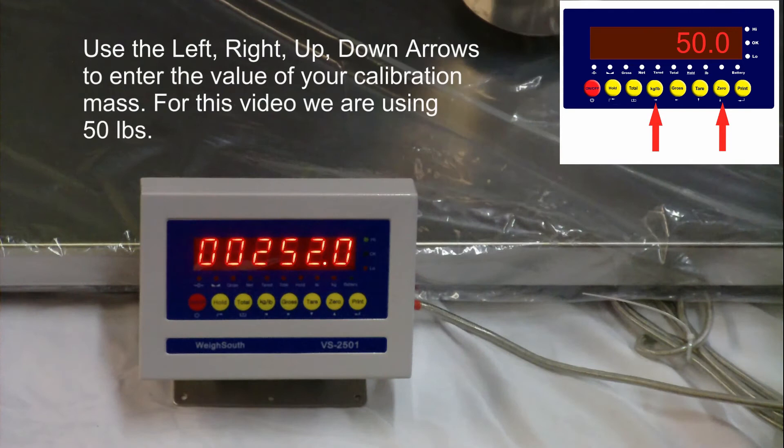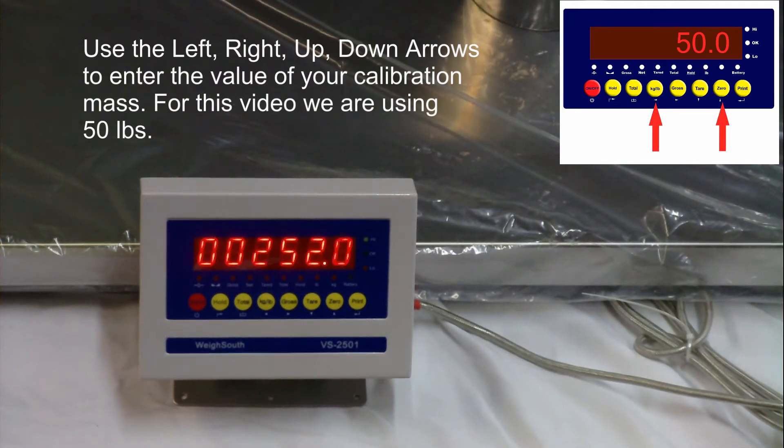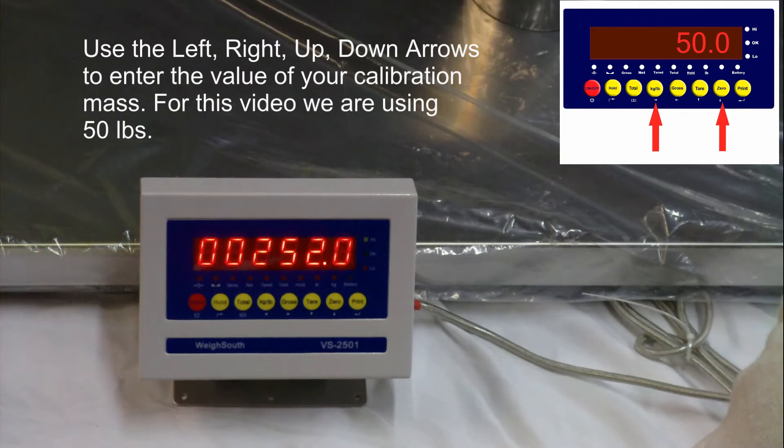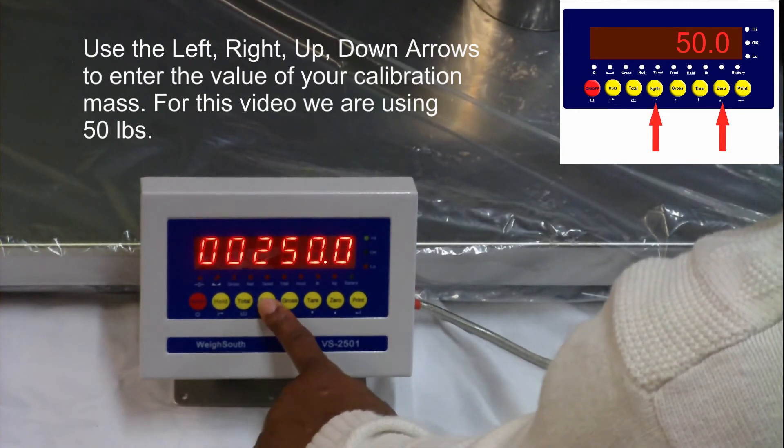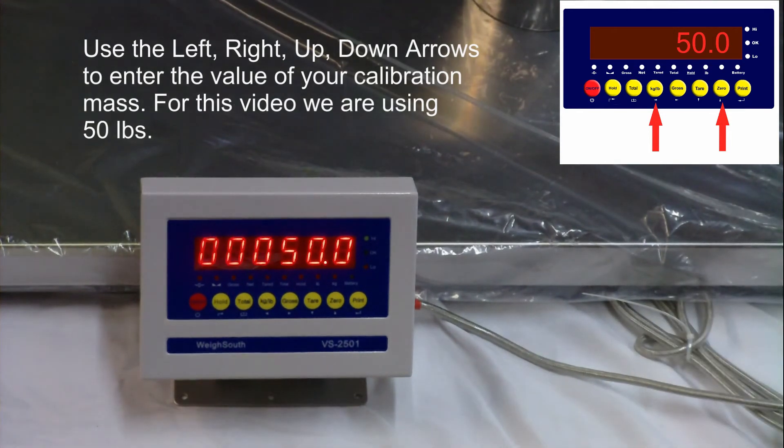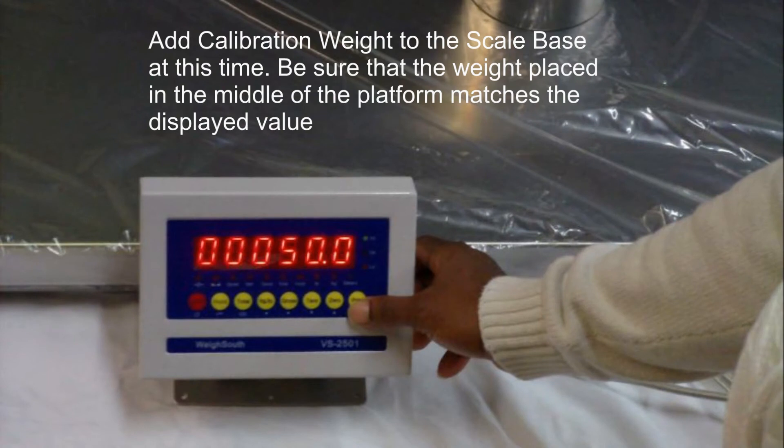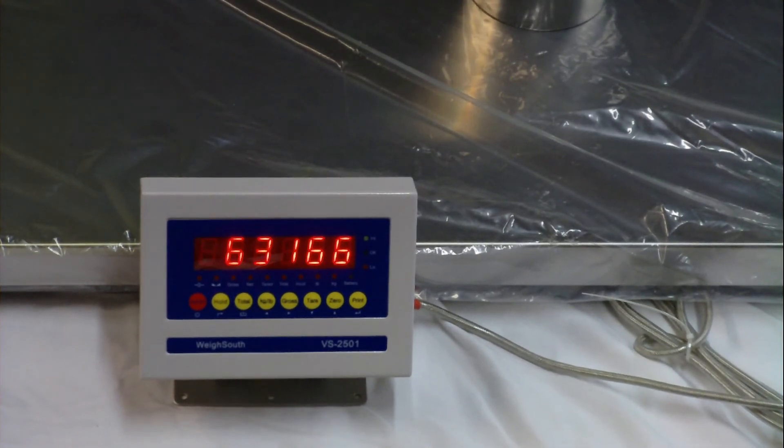At this time, use the kg pound key to enter the value of the calibration mass that you are going to use for calibration. In this video, we are going to use 50 pounds as a reference weight. So using the arrow keys, enter the value as 50. Once the calibration value matches your calibration weight, place the calibration mass on the base and press the print key. Your VS2501 will countdown and display cal in.